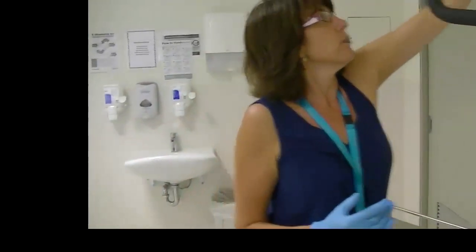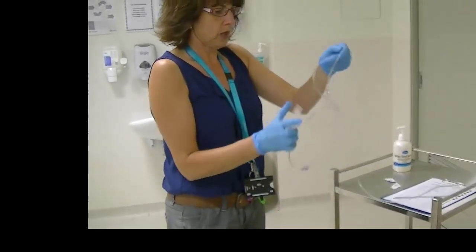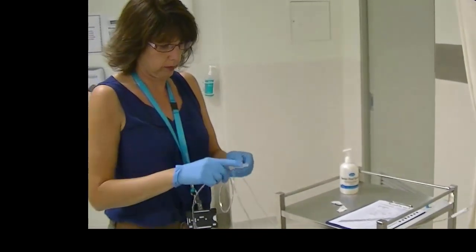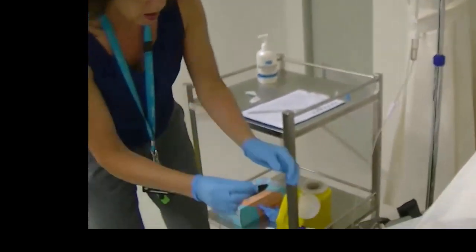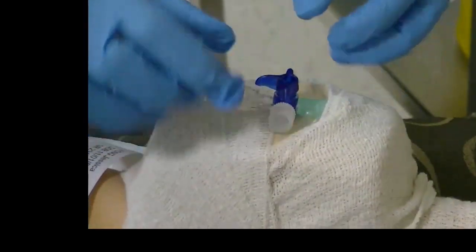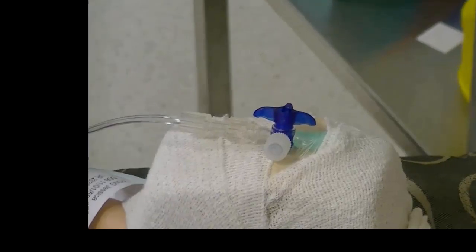Oops. This line's still got a cap on it. Managed to tangle it, that's okay. Good. Right. Here we go. It's Luer lock, so I push it in and give it a gentle turning action. And now I will turn the line on. So wherever these wings are facing is on. Great. Now I will take my gloves off.